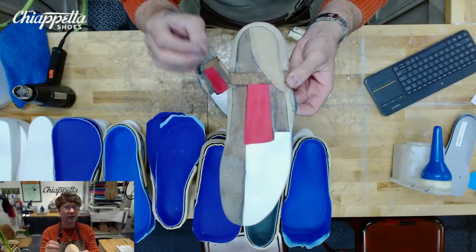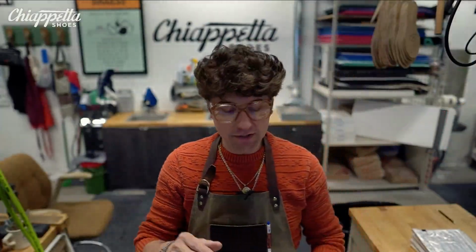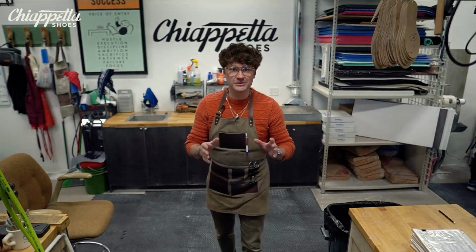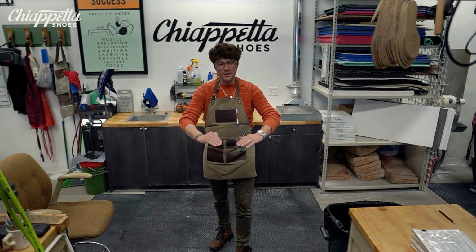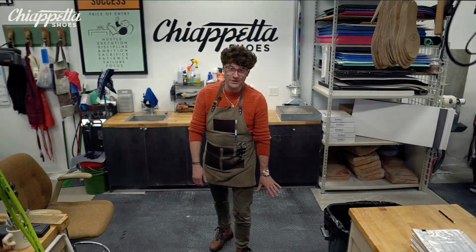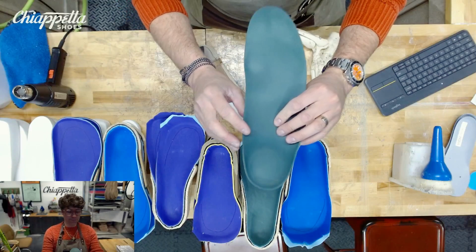The main issue this customer has been dealing with is when he has worn these for about 2 months, he's almost getting too much support, where specifically on the left side, he's having a lot of medial knee pain. What I think is going on is that we're balancing the weight off in the foot and holding the foot properly, but that lateral heel wedge is tilting the knee in too much. He also has noticed that with usage, it almost feels like the medial arch is riding too much here.